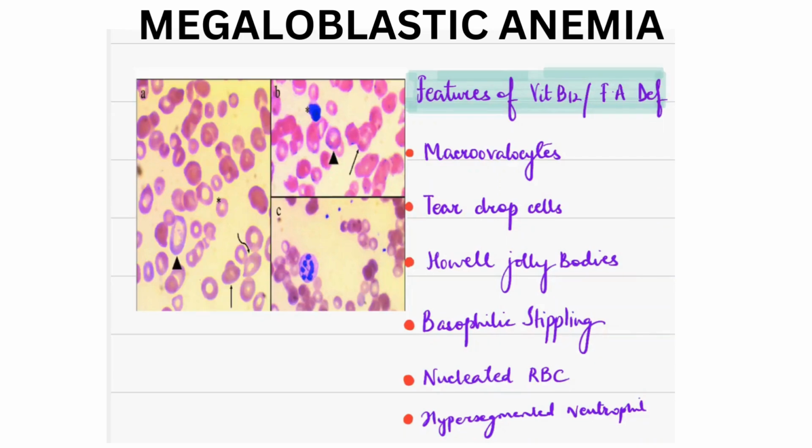Besides, we have talked about different shapes, different sizes, but now let's talk about what if the RBC size is greater than a small mature lymphocyte. This peculiar size is most commonly found in vitamin B12 and folic acid deficiency, intrinsic factor deficiency, pernicious anemia. Okay. Now, what are these called?